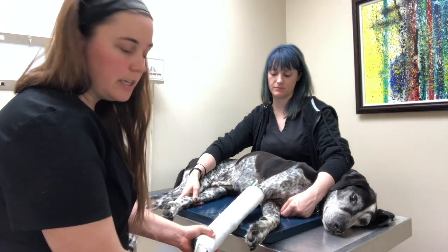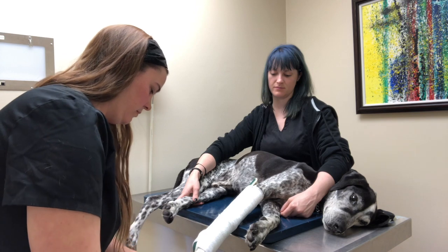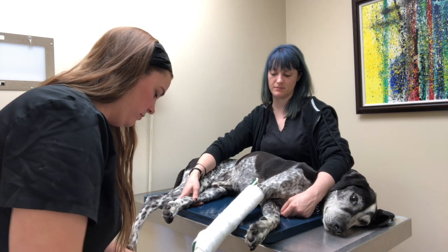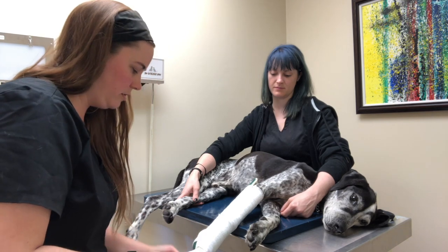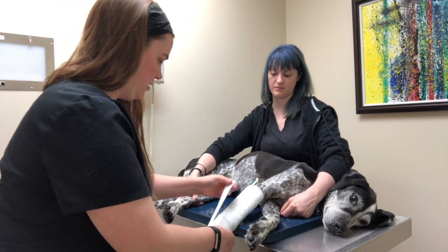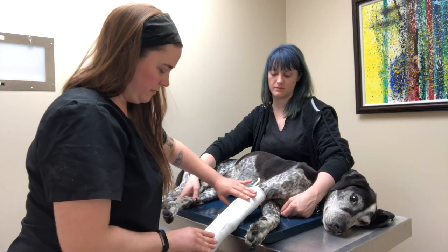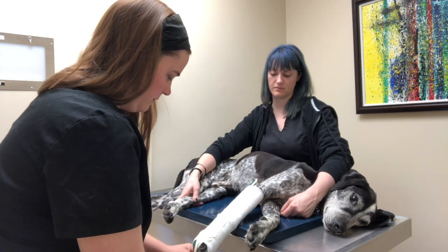At this point, you want to take your stirrups away from our tongue depressor. We're going to twist it and help it to secure our gauze layer on each side.